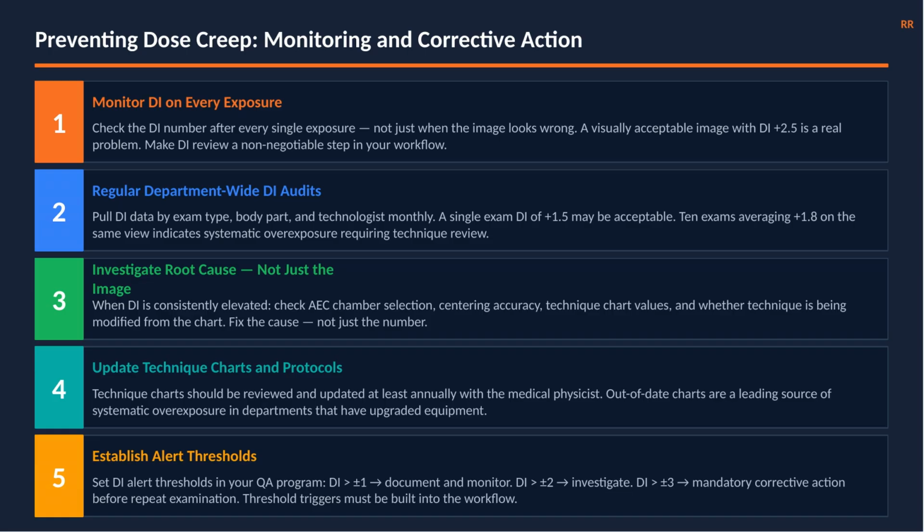3. Investigate root cause, not just the image. When DI is consistently elevated, check AEC chamber selection, centering accuracy, technique chart values, and whether technique is being modified from the chart. Fix the cause, not just the number.